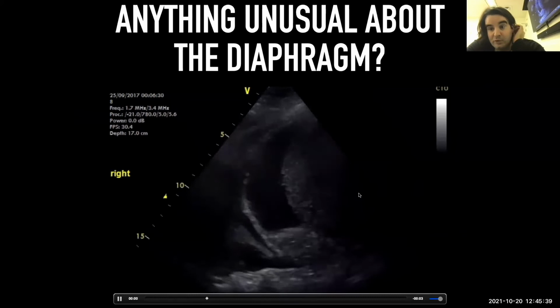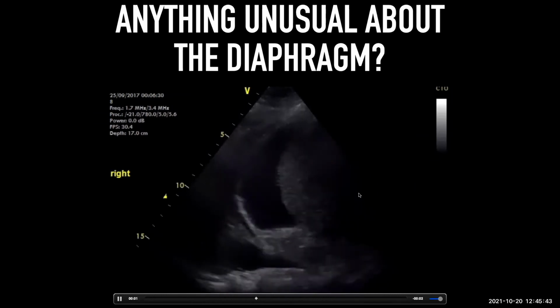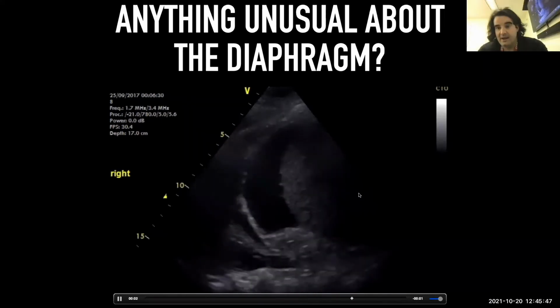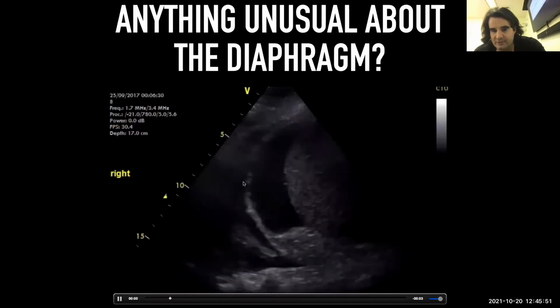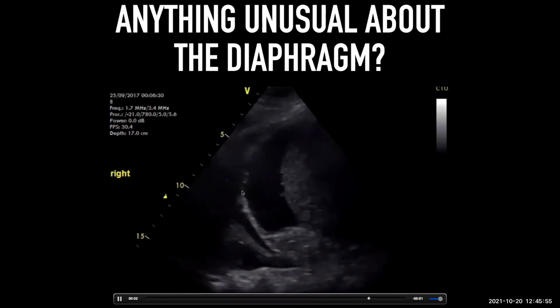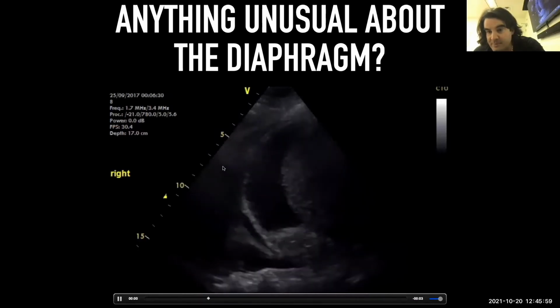Maybe I'll ask, is it moving normally? Doesn't seem to move at all, Brian. Yeah, so this diaphragm's not really moving at all. In fact, if you look at it closely, what you'll notice is that it's actually moving upwards. In fact, it's moving upwards during inspiration.